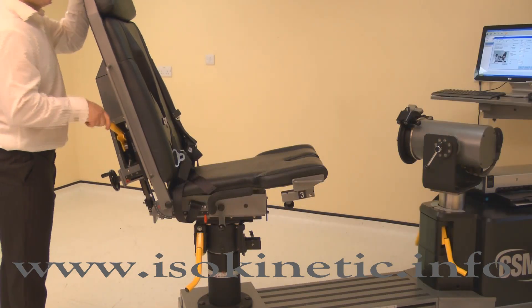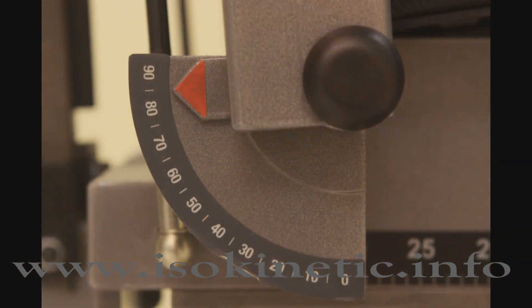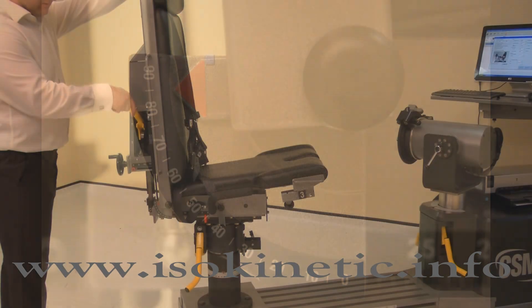To set the chair back angle, lift a locking handle and adjust the chair back. For the knee, adjust the chair back angle to 85 degrees, then push the locking handle down to secure.